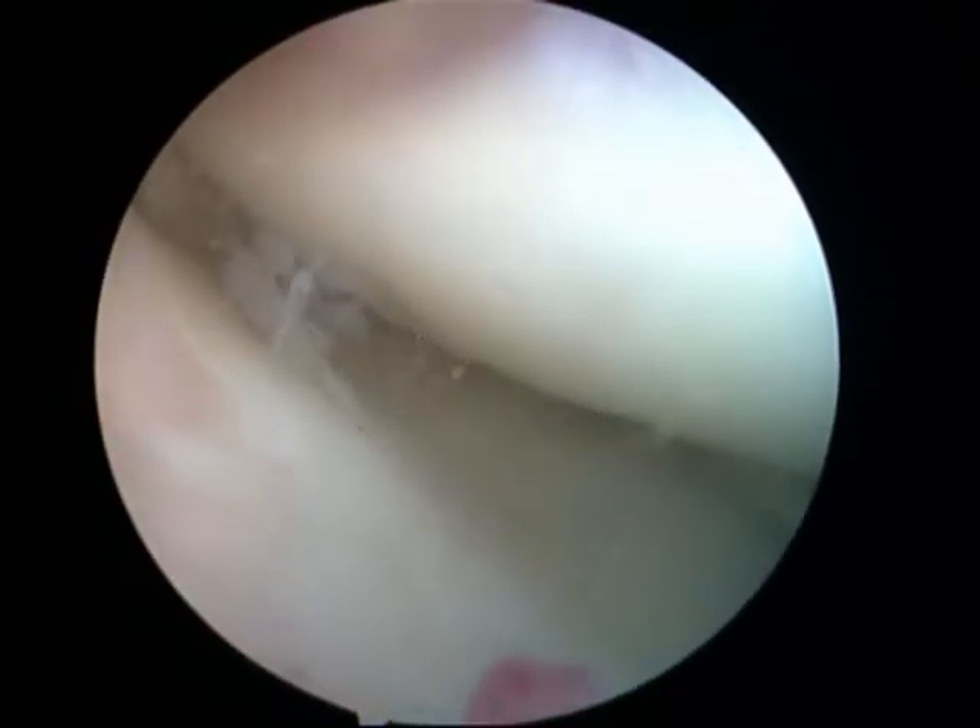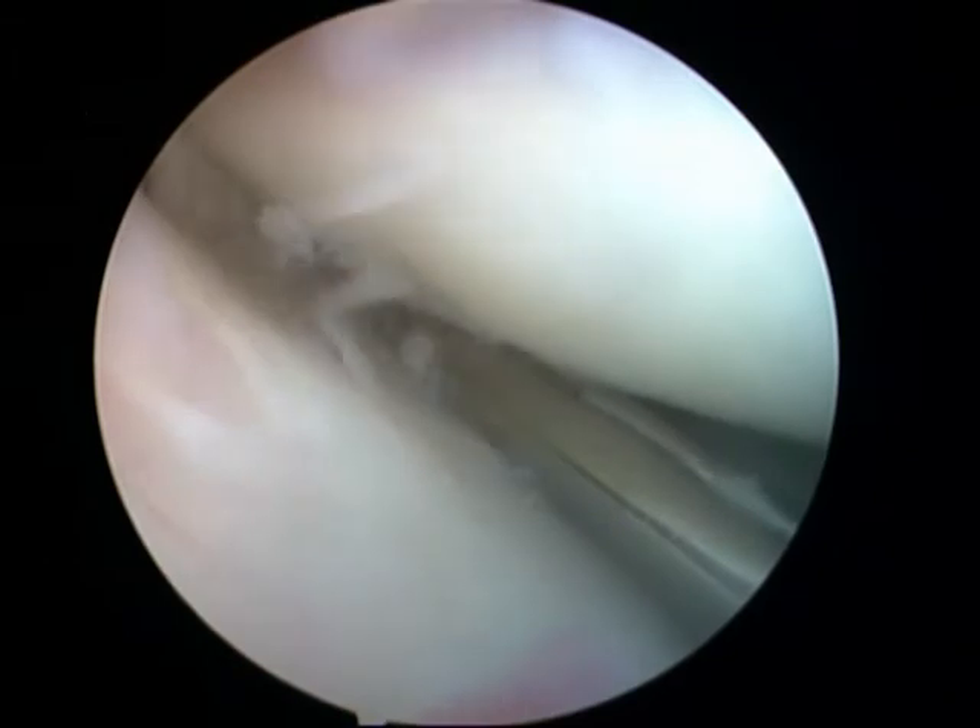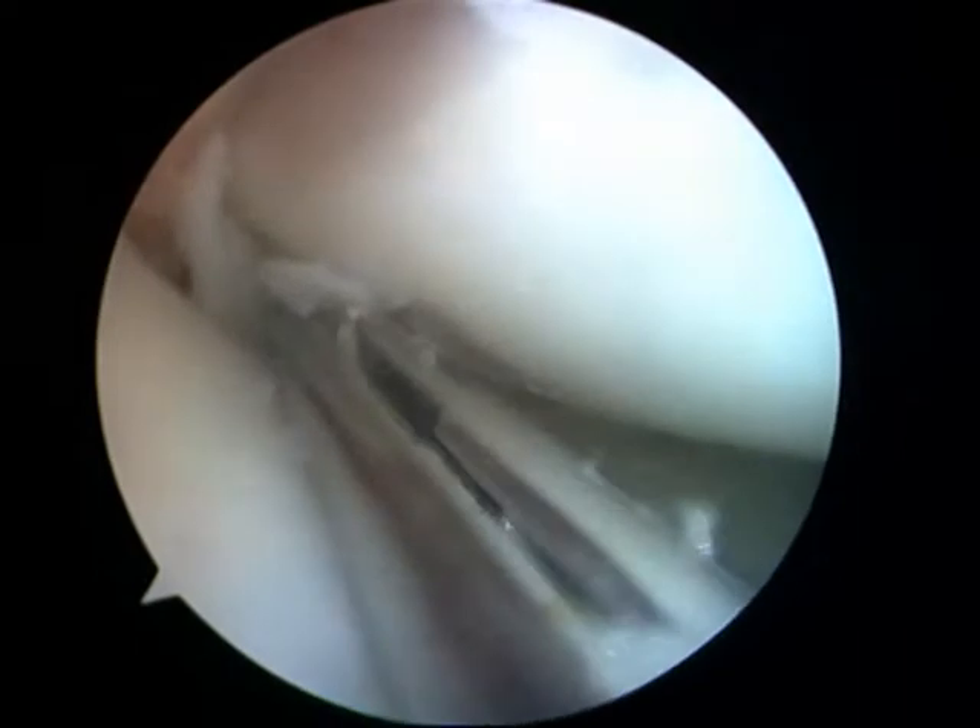There's a camera in there. It's quite an alien light. Sorry I haven't got any sound effects of sawing and hacking.